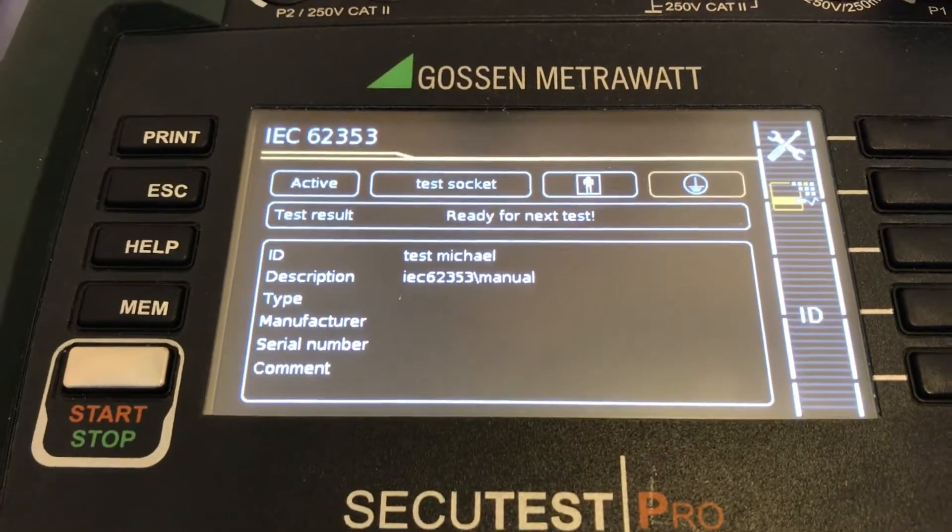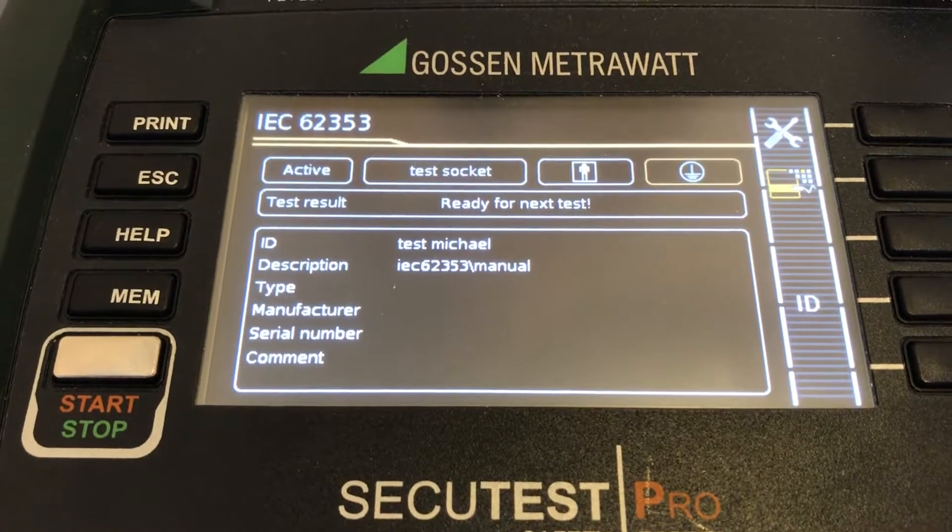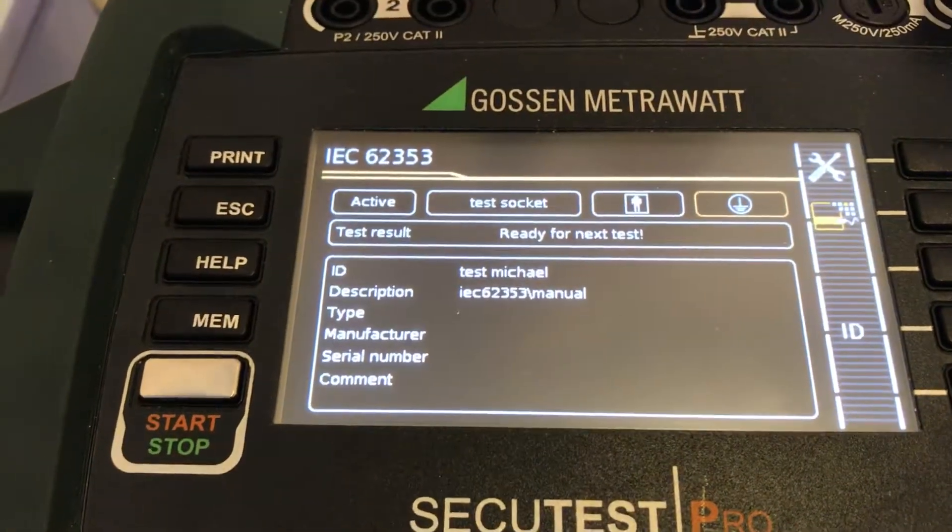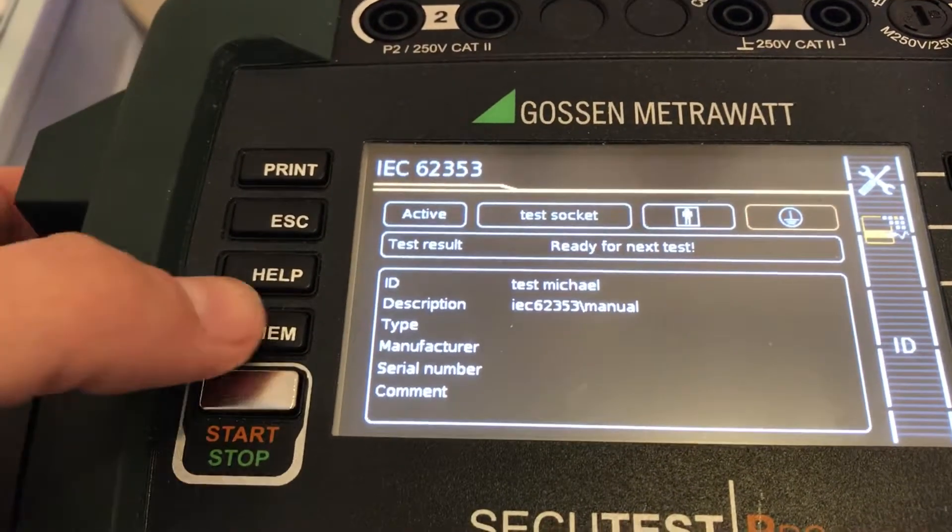Today I'm going to show you how the Gossen-Metrawatt Secotest Pro electrical safety tester works against different types of norming.